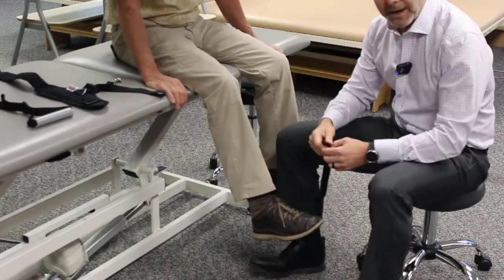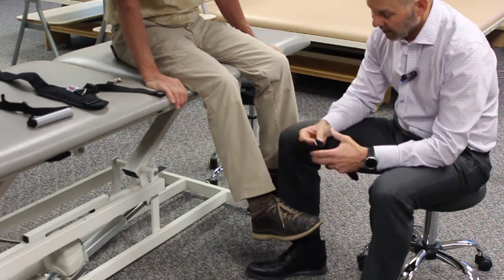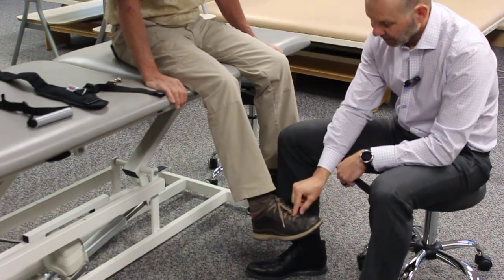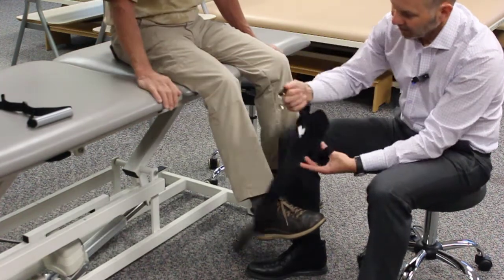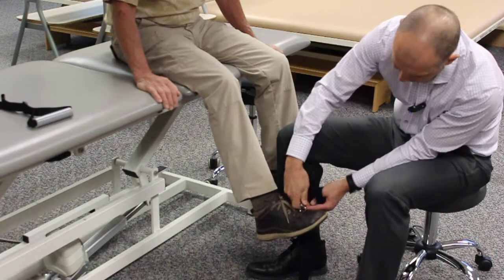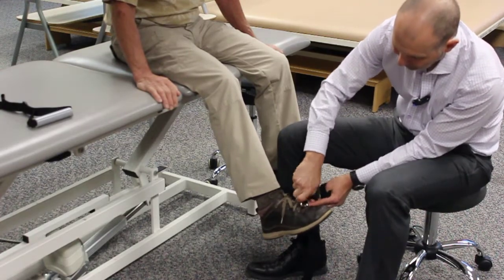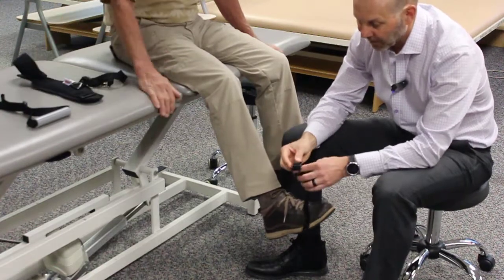This is how to apply the Easy Step training device. If a person has shoes with laces, you can just clip the device directly to the laces if you like. However, the other option would be to use the toe strap that we have.